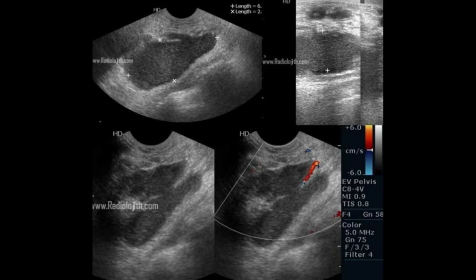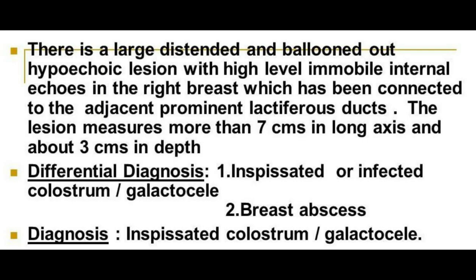The third case reveals a large, distended, and slightly ballooned-out hypoechoic lesion with internal echoes. Few connections are noted between the lesions. No vascularity is noted within the lesion, though some vascularity was noted in the wall. The differential diagnoses are: one, galactocele; two, inspissated or infected colostrum; three, breast abscess.